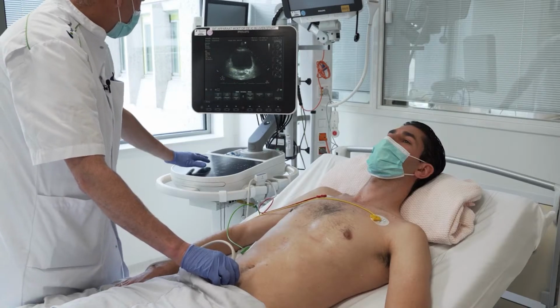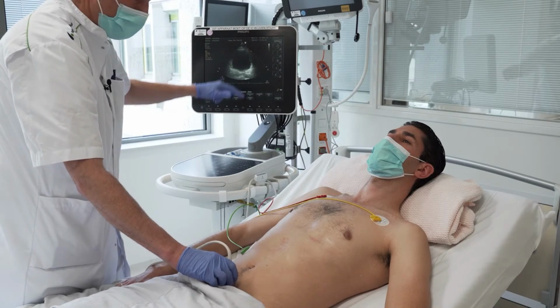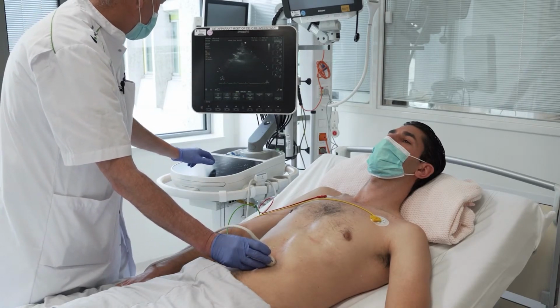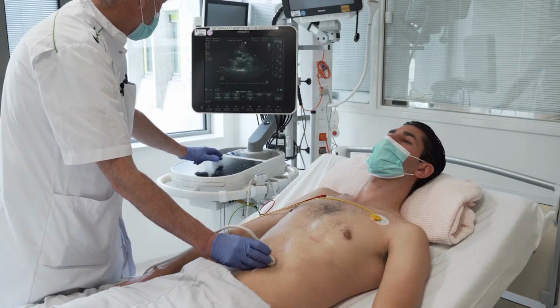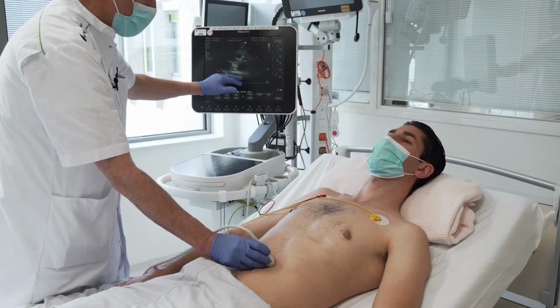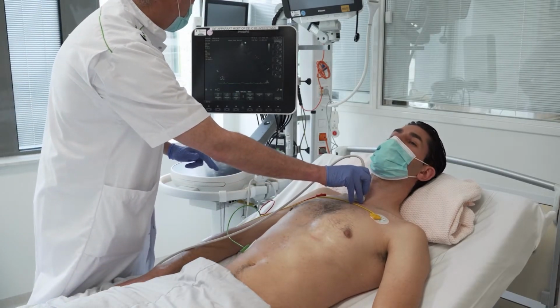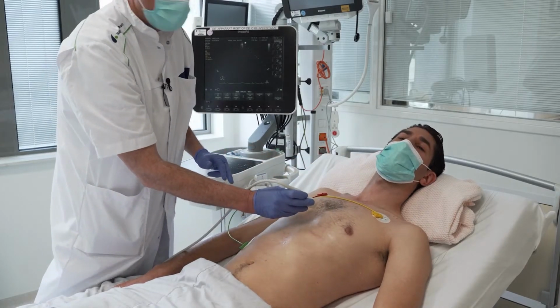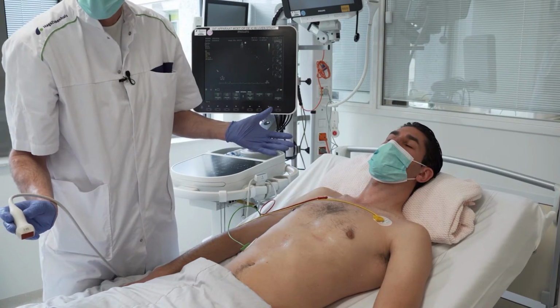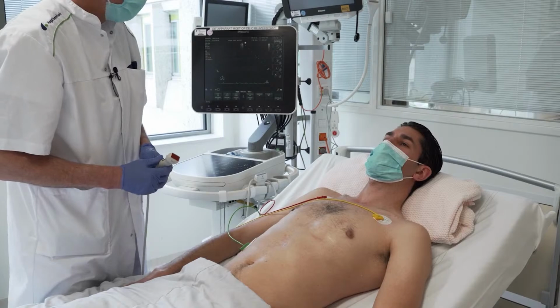I see a bladder. I see no free fluid. I go to the upper abdomen looking for the aorta. It looks nice, so no problems there. And if I want, I can go to the suprasternal view where my colleague was more successful than I. So this takes me maybe a few minutes, yeah. Sakir? Yeah, of course. So it's very fast and reliable.